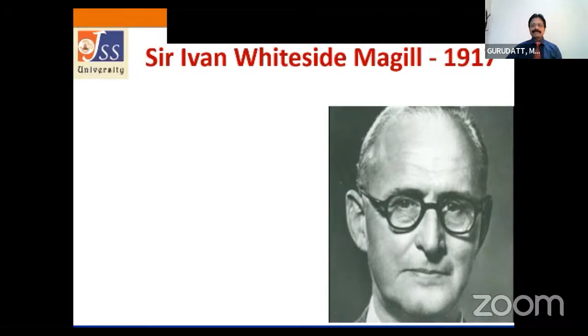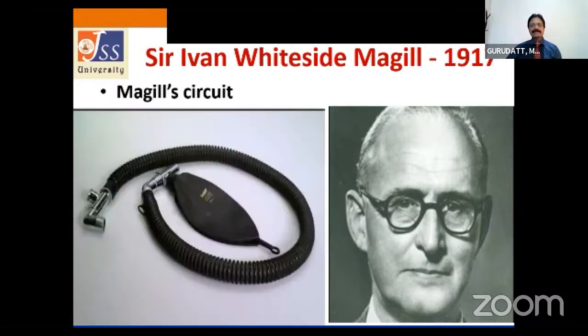Sir Magill is considered the father of modern anesthesia. He has many contributions. One of the contributions is a circuit which is called the Magill circuit. Presently, after the classification by Mapleson, it is called the Mapleson A circuit.